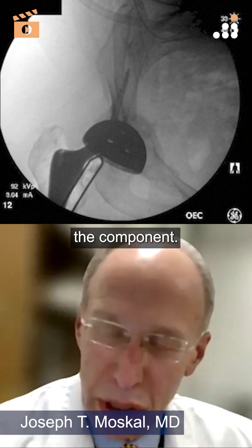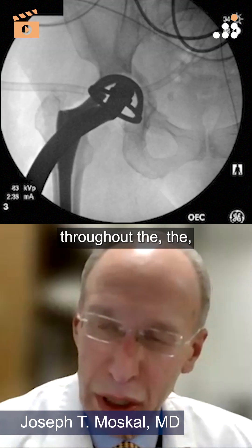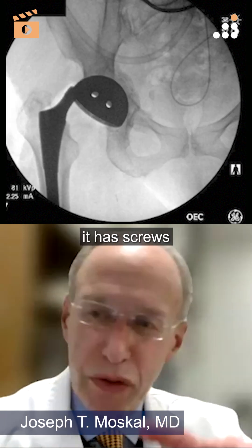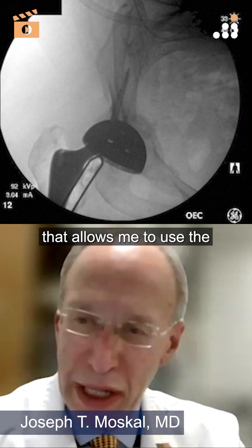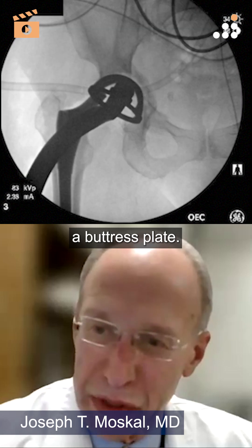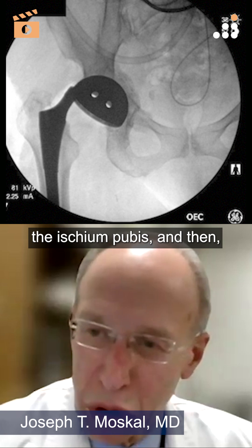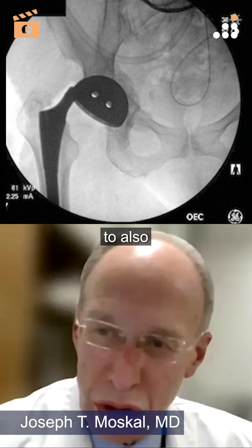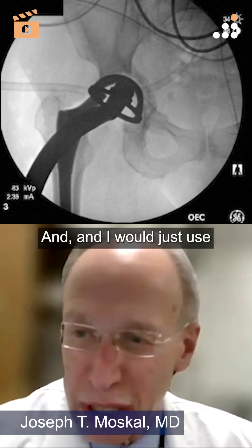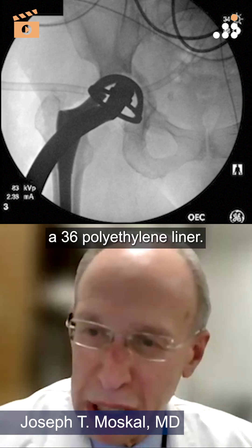It allows me to lateralize the component, and in addition to having multiple screw holes throughout the acetabular sphere, it also has screws around the periphery that allow me to use the outside of the plate almost like a buttress plate — putting screws into the ilium, ischium, and pubis. I would just use that along with a 36 polyethylene liner.